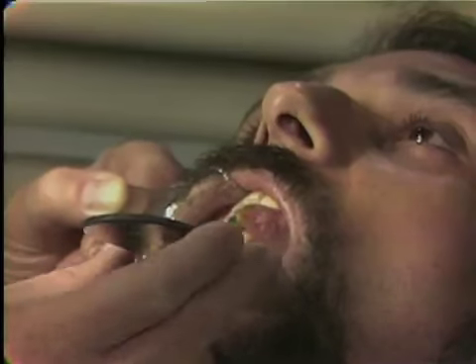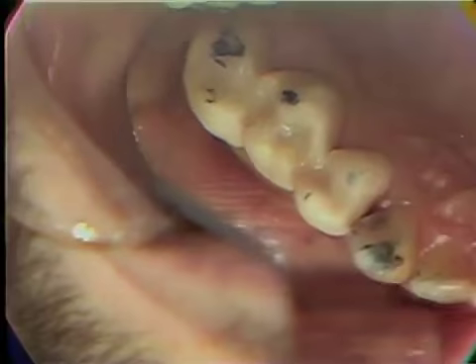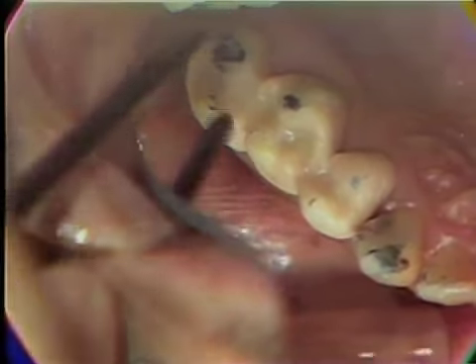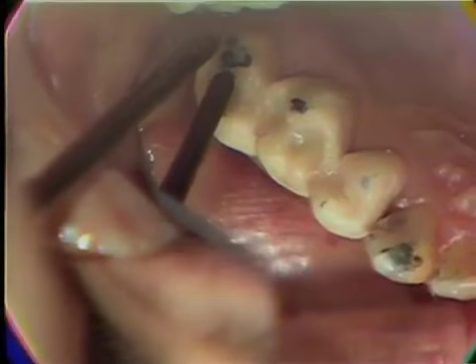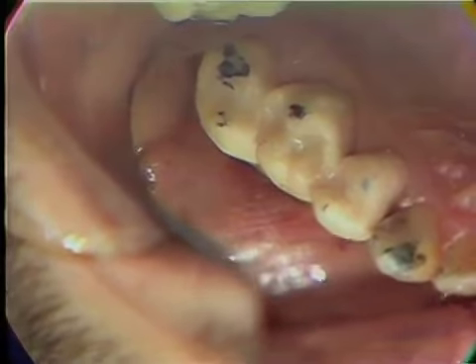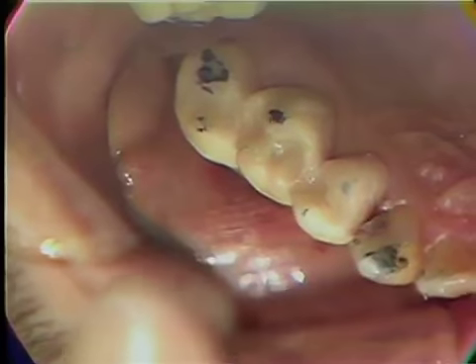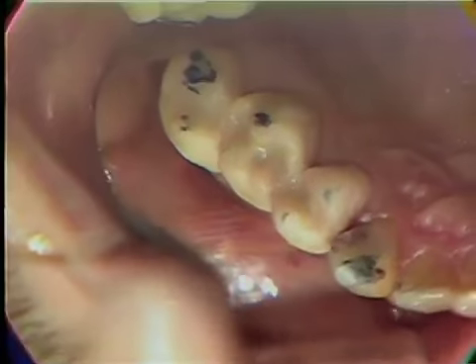As you see here, we would like to have the same small areas of contact on the teeth. We would want to not have any balancing interferences. This area should be reduced a little bit to where we have less area of contact. But the occlusion is important in the temporaries, because if you put in a faulty occlusion and it causes the teeth to move orthodontically, then you've defeated the purpose of the temporaries.